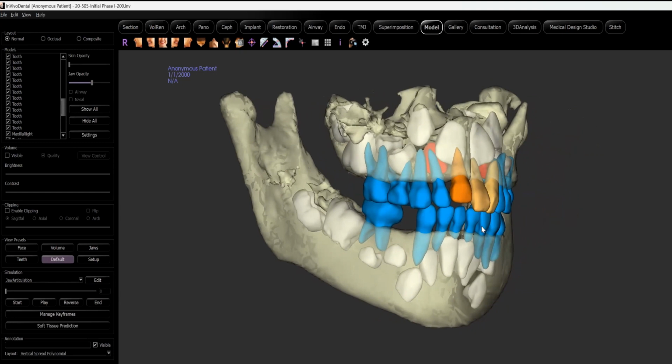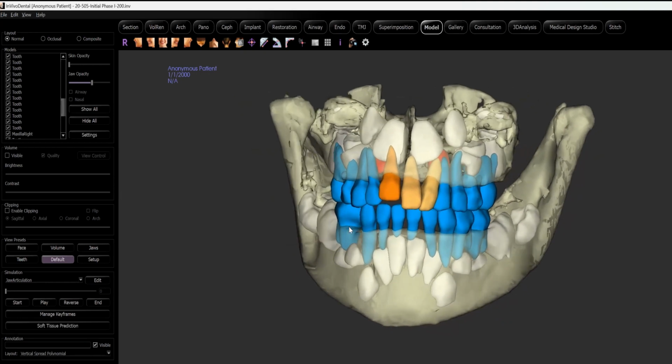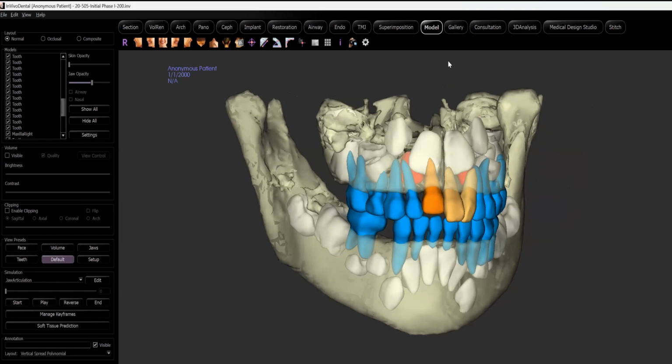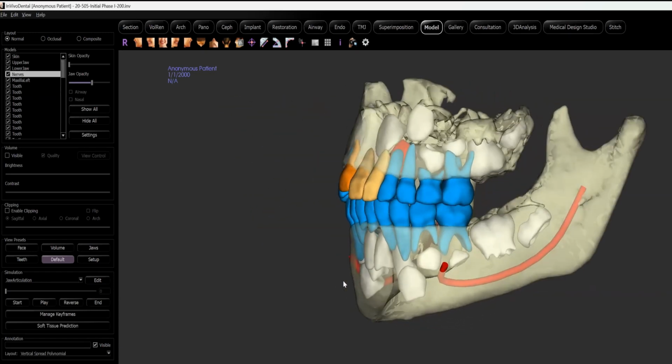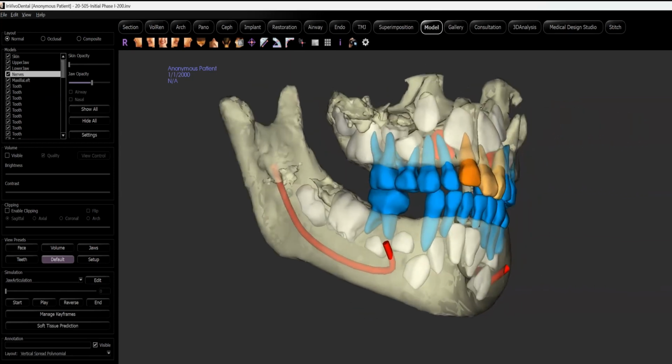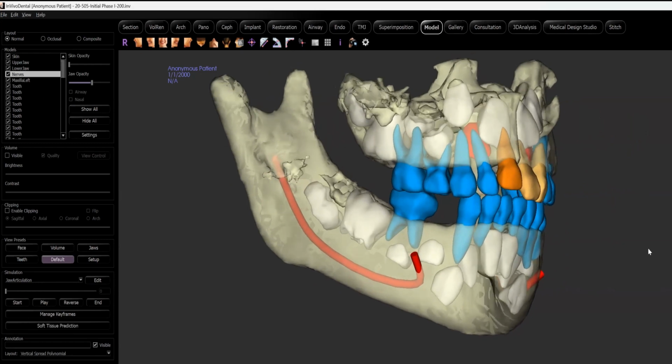Okay, it's a 3D functional dynamic model that you can use to really see, and to see is to know, and to know is to understand, right? On top of this model, the company will segment the nerves, the inferior alveolar nerves, which may not be too relevant for orthodontic purposes, particularly in a case such as this, like mixed dentition, but it may become more relevant later on with adult patients that need implants or third molar extractions and so forth.